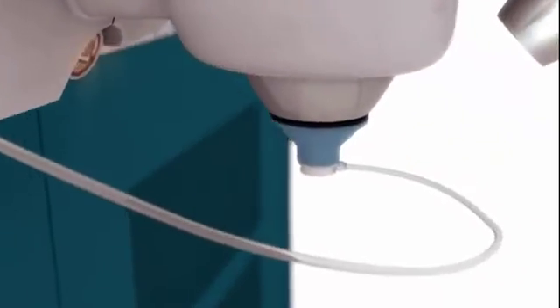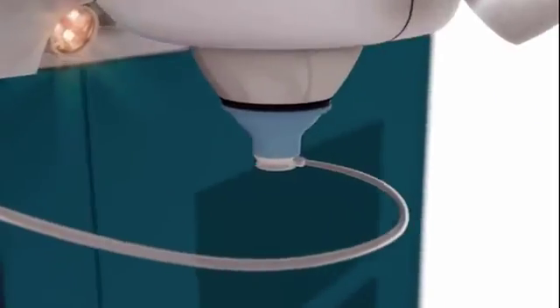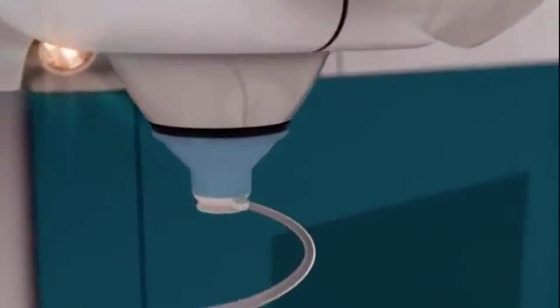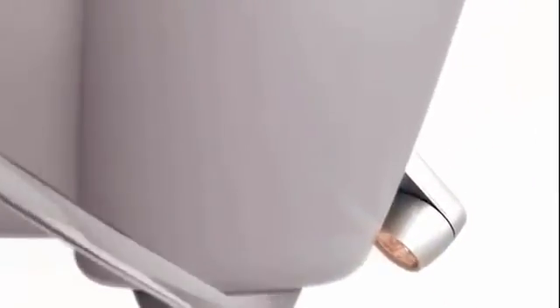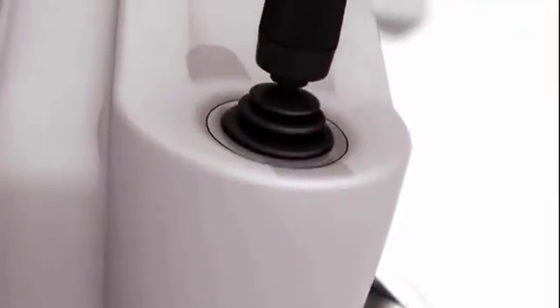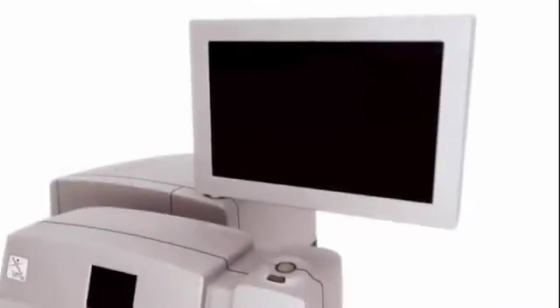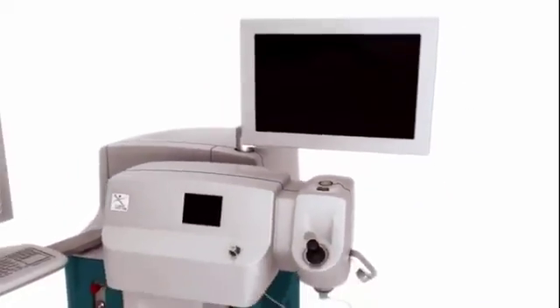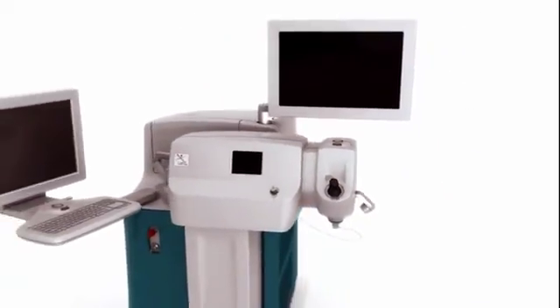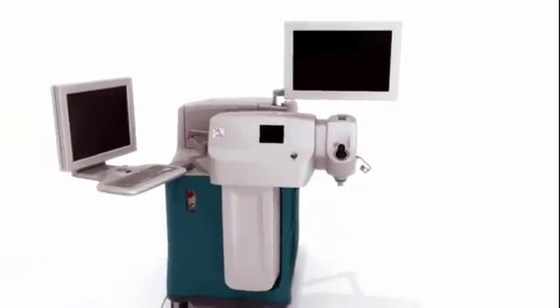The first femtosecond laser cleared for applications in cataract surgery, Alcon's LensX laser is an image-guided surgical breakthrough. Providing cataract patients with a blade-free, technologically advanced alternative, the LensX laser is leading a new era of refractive cataract surgery innovation.